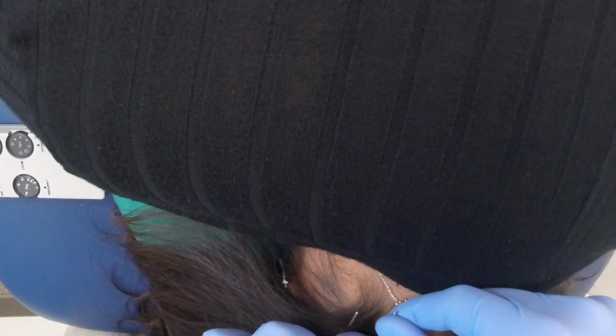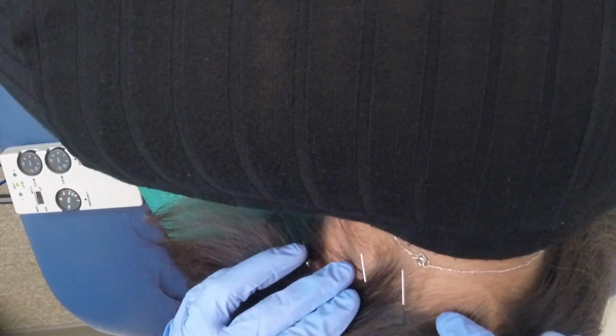So once we identify that, we do a quick firm tap of the needle, goes down within a second or two to the area that we are looking for. We're always knowing where we're at by using landmarks and knowing anatomy. So we're always staying safe and minimizing risk of anything happening.